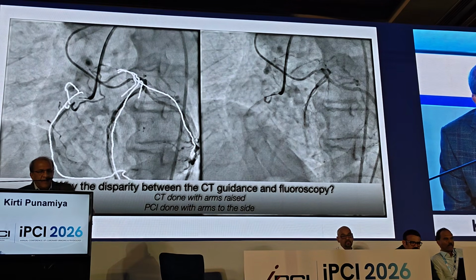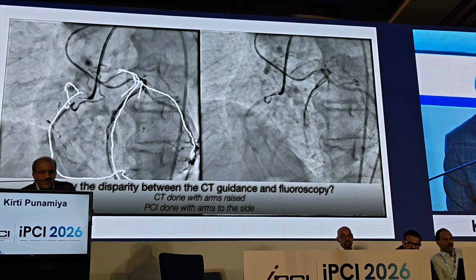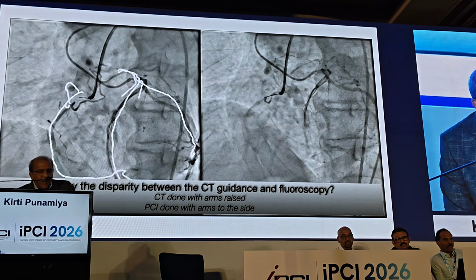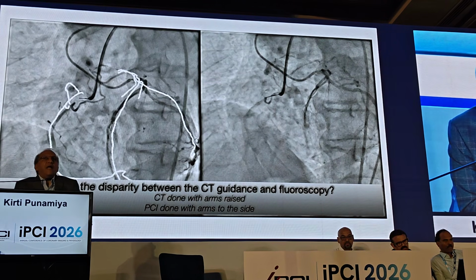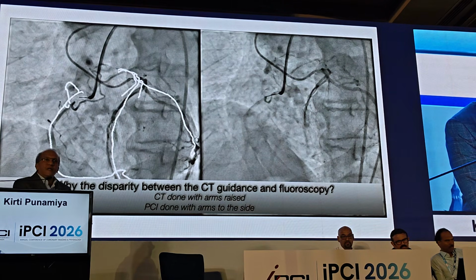Now, with that path, you then know you're in the right direction because you're heading towards the distal cap here. You can see that the white lines don't match your coronary lines. There's a little discrepancy. So why is that discrepancy? Why is it not a perfect match?